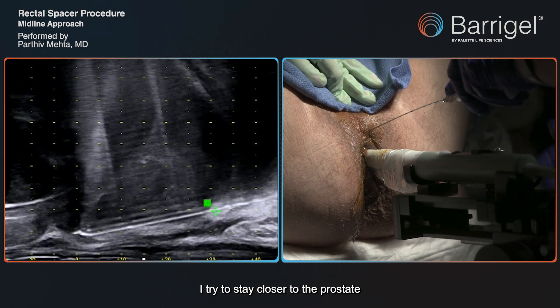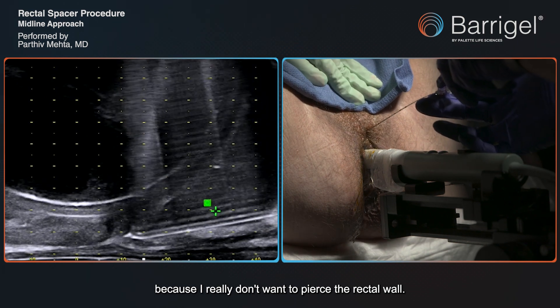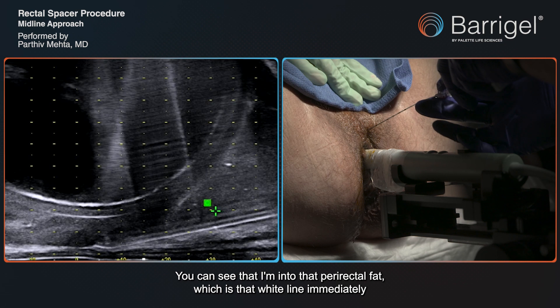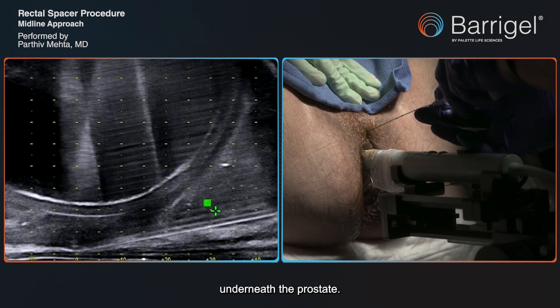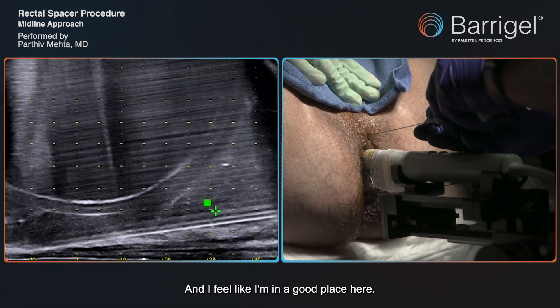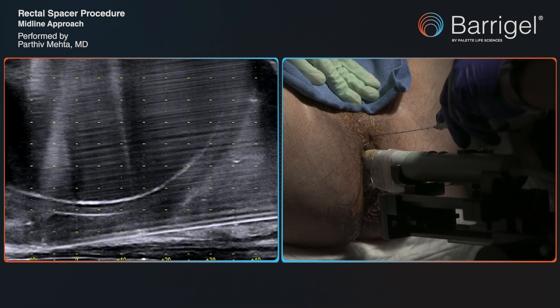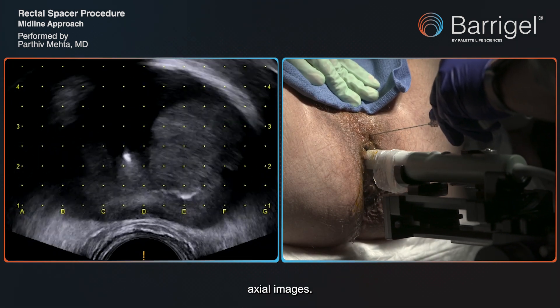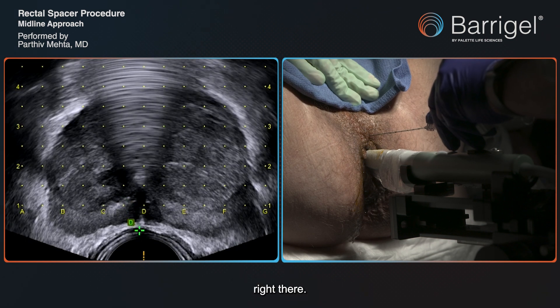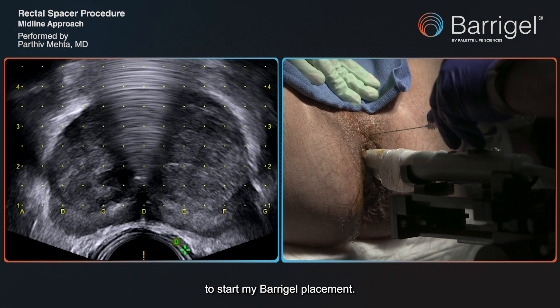I try to stay closer to the prostate because I really don't want to pierce the rectal wall, so I just kind of hug the posterior aspect of the prostate. You can see that I'm into that perirectal fat, which is that white line immediately underneath the prostate. I feel like I'm in a good place here, and we can verify that by going to our axial images. You can see my needle tip right there, and I'm not into the rectal wall, which means I'm in a reasonable place to start my BaríGel placement.